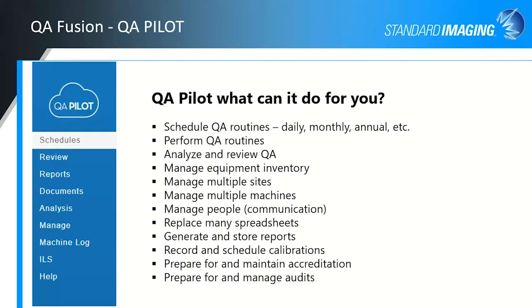So what can QA Pilot do for you? I think I've gone over that quite significantly in these slides, but as a reminder to that first list, here's the summary, which represents everything except for the patient QA side of things. We have our LINAC View and Adaptivo products that are a very intense and comprehensive solution for your patient QA.